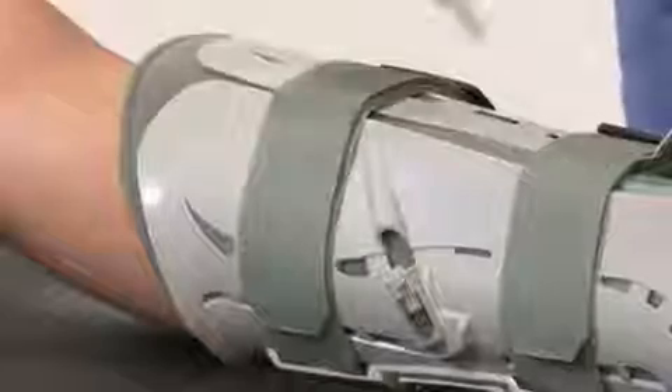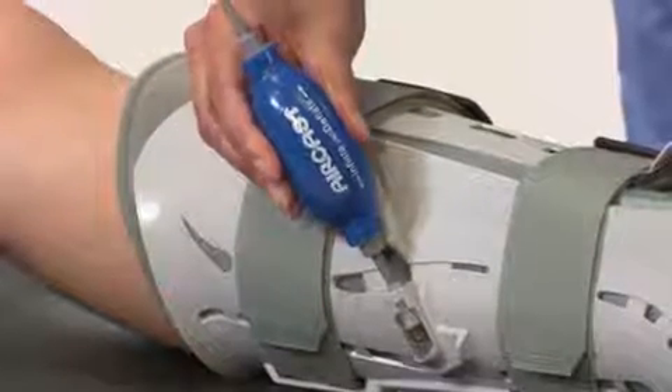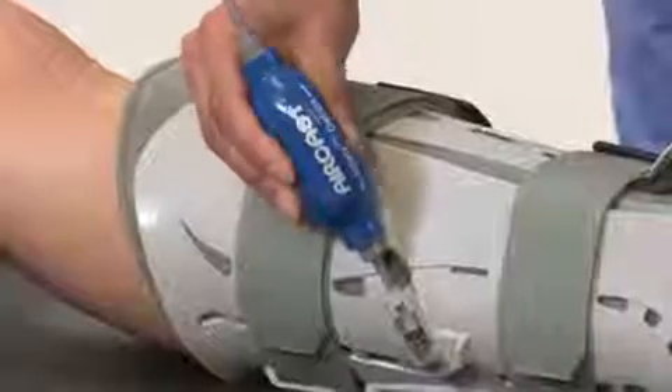To inflate the air cells, firmly insert the inflate tip of the hand bulb into the valve and squeeze until the air cell is snug.